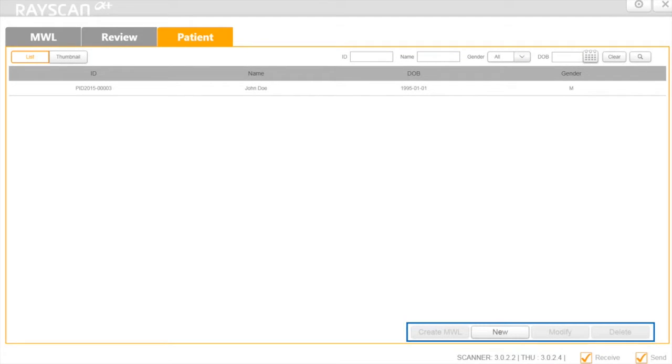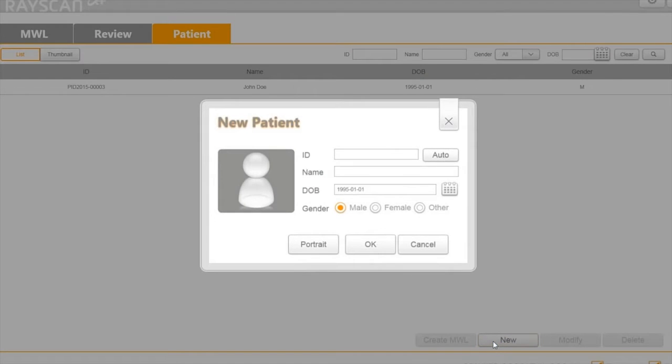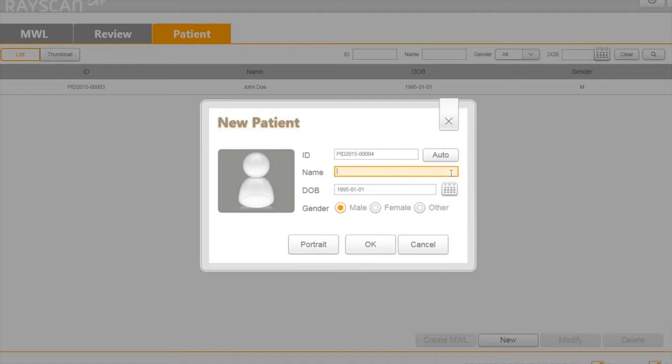To register a new patient, click the New button. You can use the Auto Generator or manually type in your order. Type the patient's name and select the gender.